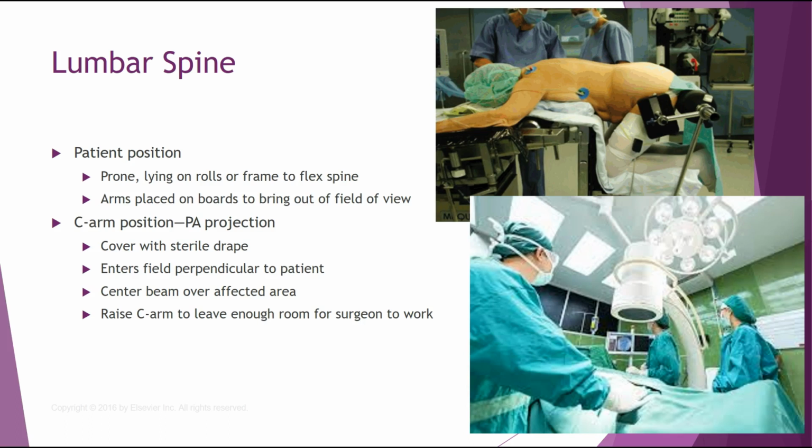Raise the C-arm to leave enough room for the surgeon to work. And that's just if you're going to leave the C-arm in the room for the surgeon, okay?